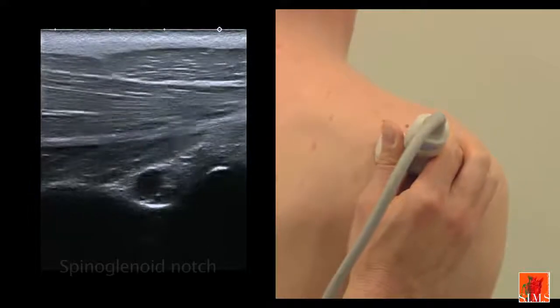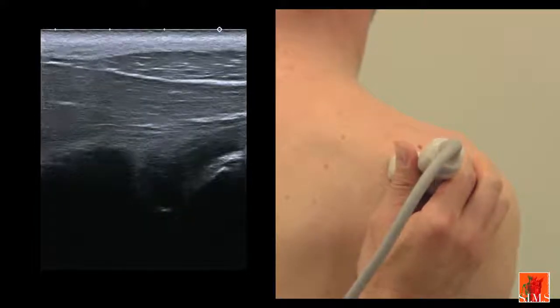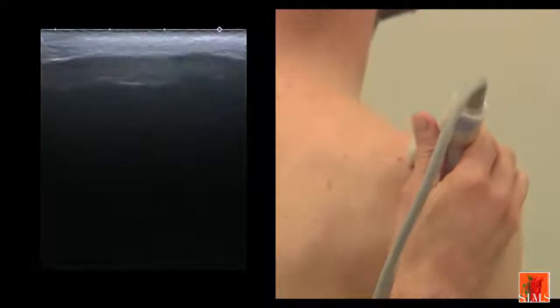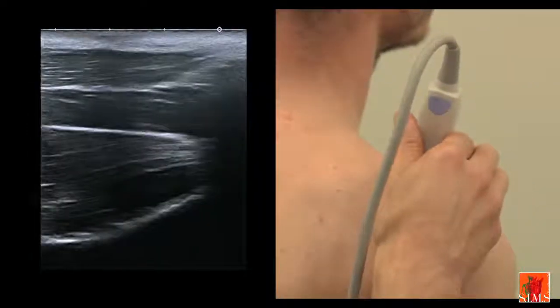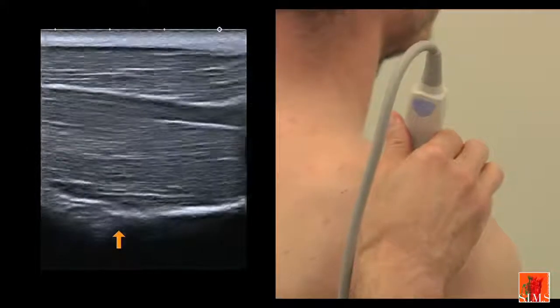Travelling upwards, still in an axial plane, and following that pedicle along the deep surface of the infraspinatus muscle, we will see it go under the spine of the scapula — this is a blind zone. We then pick it up again in the supraspinous fossa, still in contact with the scapular bone, and follow it upwards as far as the suprascapular notch.